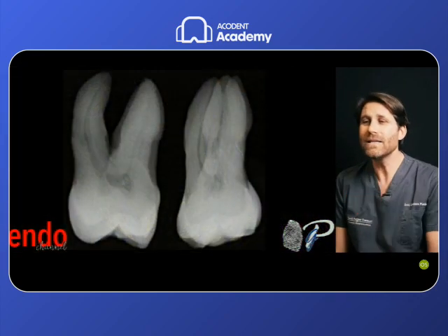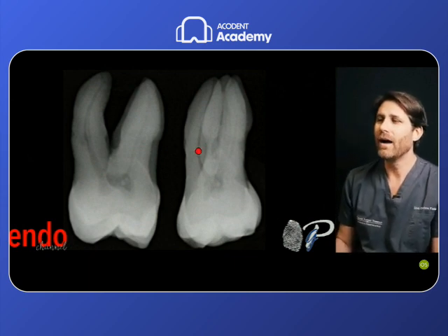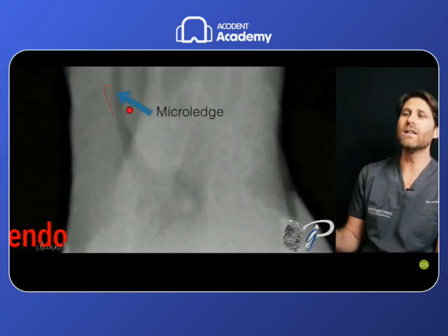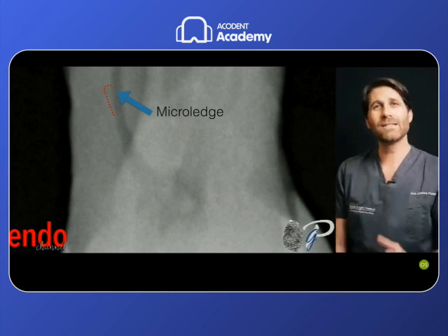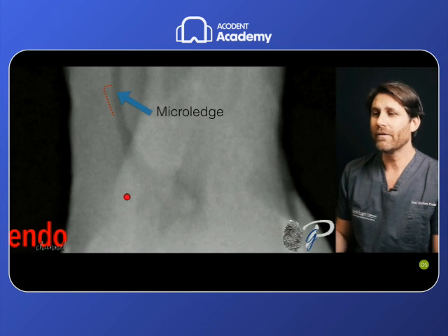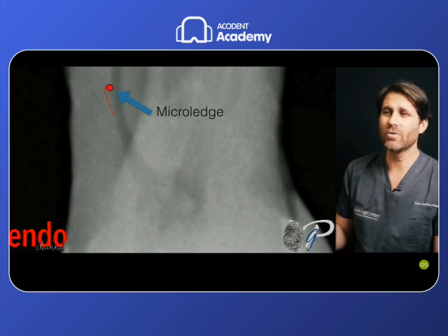And if we insist with manual files in scouting this anatomy, it is possible to create a micro ledge in this area, at this point, in which the tip of the file pushes against the center of the coronal curvature, because it's pushed there by the dentin interference here, the very sharp, hard trajectory that it has to follow.